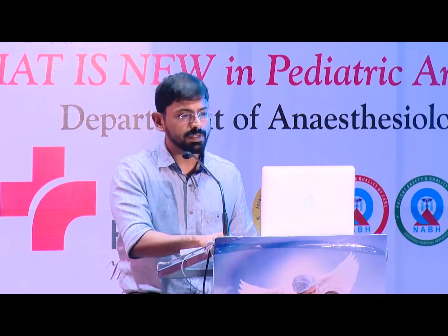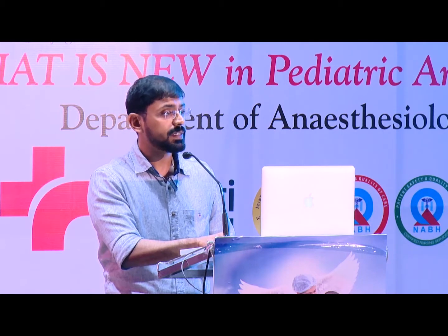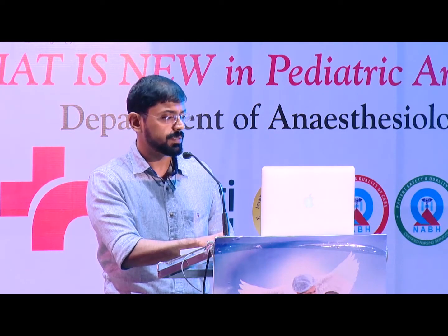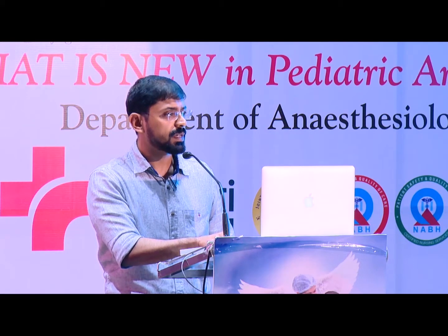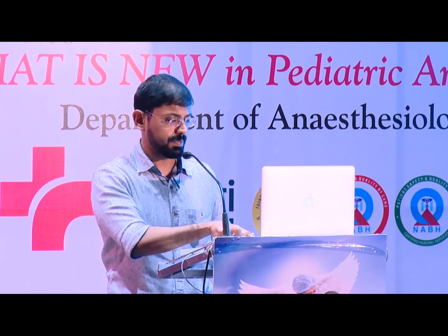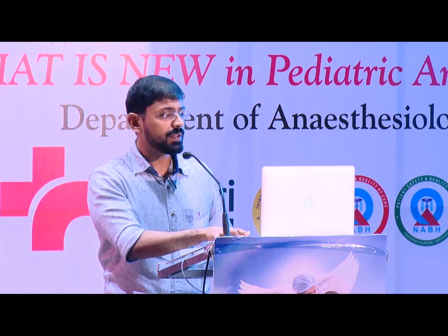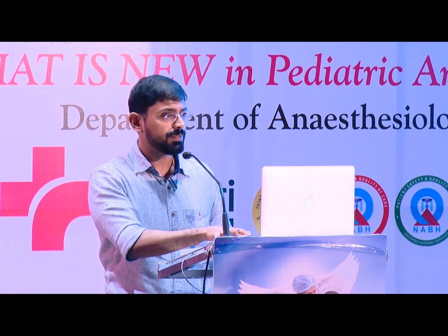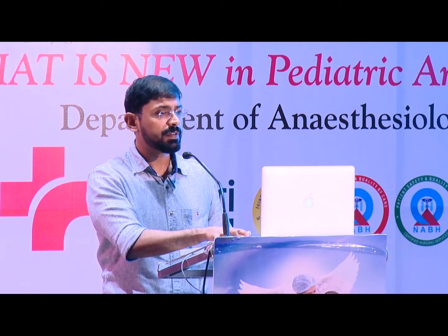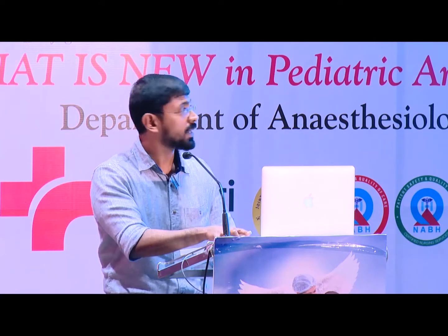He's pre-medicated prior to intubation. We give him an anticholinergic, a sedative, and a paralysing agent. They are atropine, fentanyl, and rocuronium. He is intubated with a size 3 ET tube and fixed at 7.5 centimeters at the lips. We confirm equal air entry bilaterally. There is misting of the ET tube, all of which tells us that the intubation is proper. His heart rate is fine, his saturation is excellent, and he's connected to our ventilator, the Dräger Babylog.